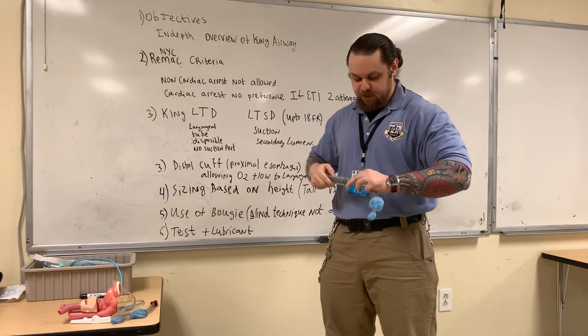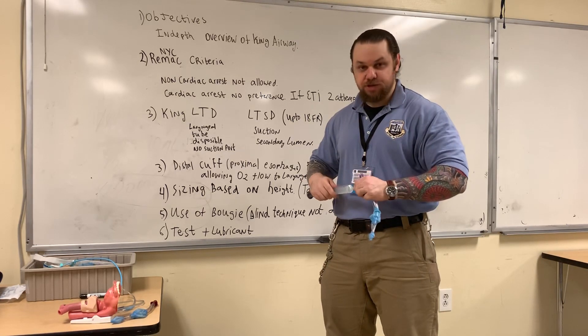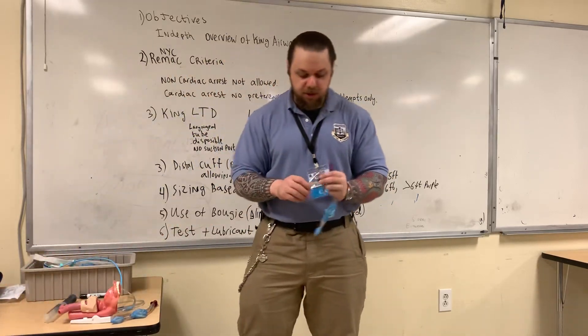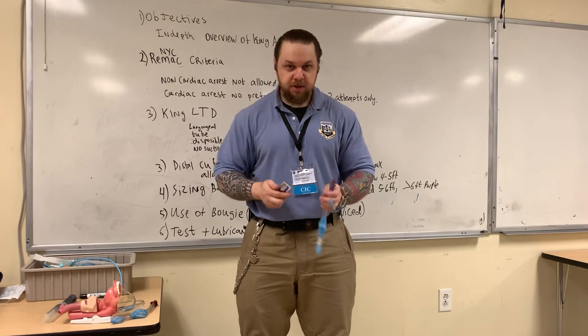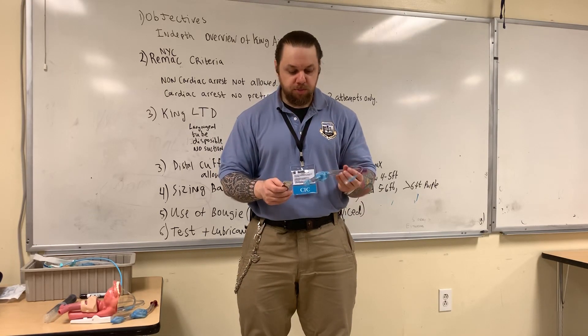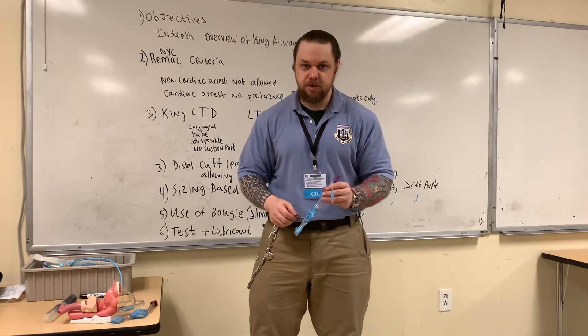You want to deflate the cuffs fully so they do not obstruct the entrance when you're inserting this into the patient. Then you're going to employ a water-soluble lubricant and lubricate the device before inserting it into your airway trainer.